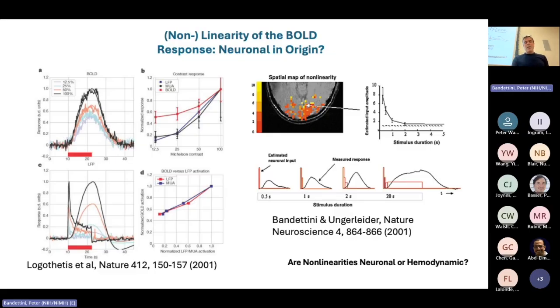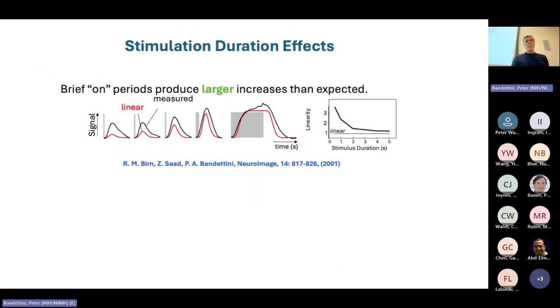Well, I mean, a linear response. So backing up a little bit. If you convolve a hemodynamic response with a boxcar function to get your activation, a linear response is just basically you're allowed to do convolution at all different durations, and it would behave a certain way. It's independent of the duration of the stimuli. This is one way of looking at it.